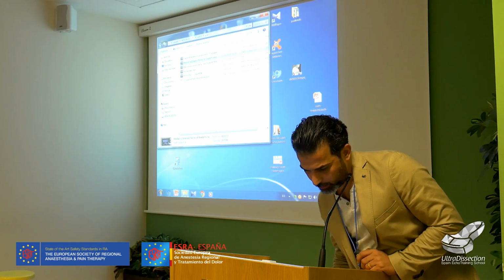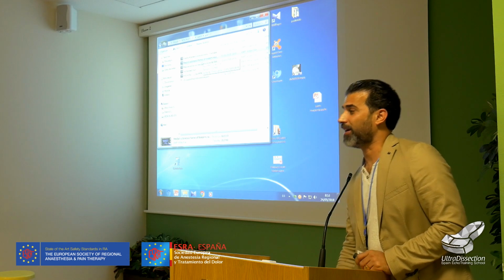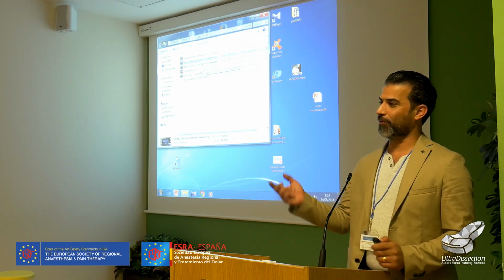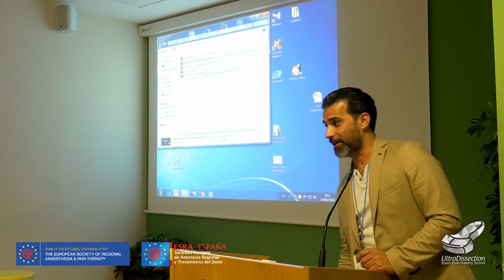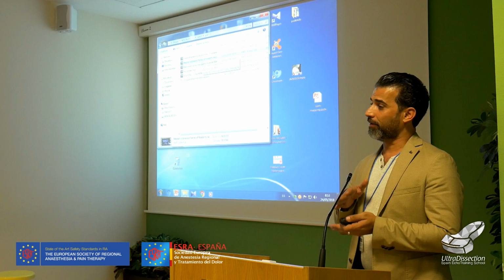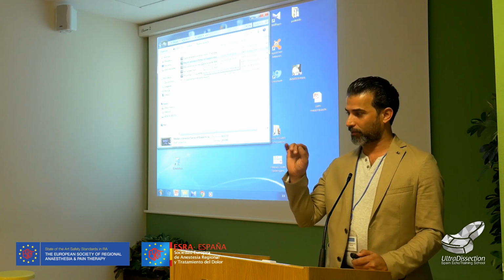The last one. One question is regarding after dissection: will it become like a compartment syndrome because of high pressure around the nerve? No, I just use 2 to 5 ml maximum. It's like when you give local anesthesia to any nerve, 2 to 5 ml, not 20 or 30 ml. Of course, it would be more compression and ischemia. So I use it for the fascial layers or the nerve under penetrating points of the fascia. Just release the fascia and then go to the perineurium.